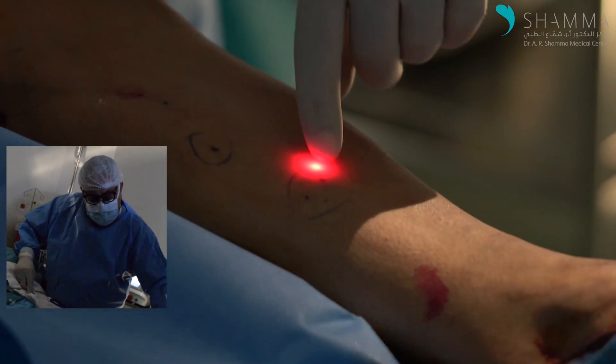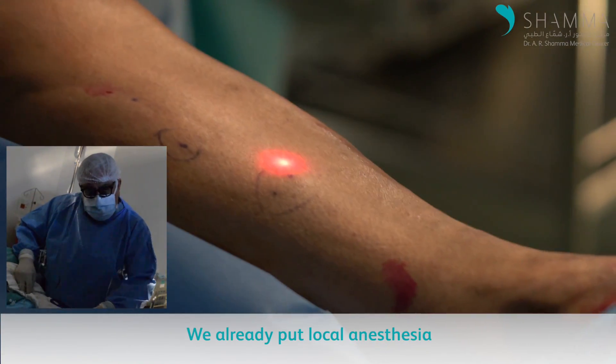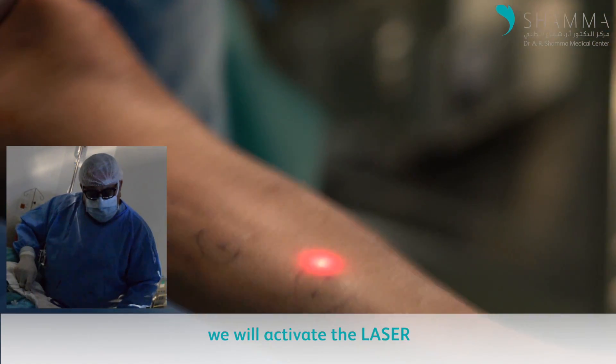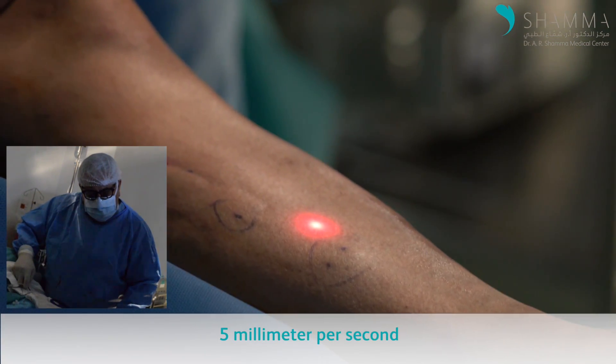You can see the laser fiber. We are going to activate it — we have already administered the tumescent anesthesia, so the patient has no pain. We will activate the laser and start withdrawing it very slowly at a rate of 5 mm per second.